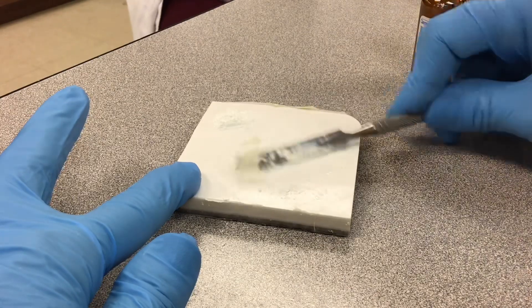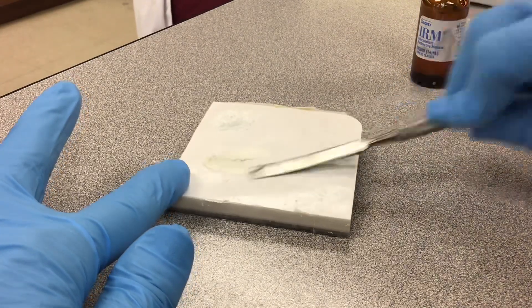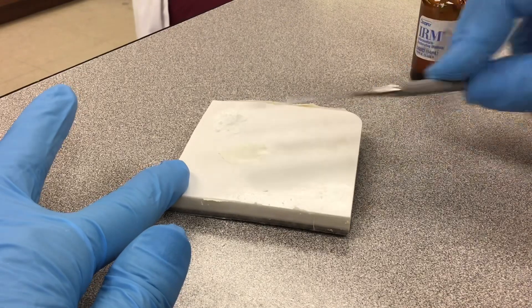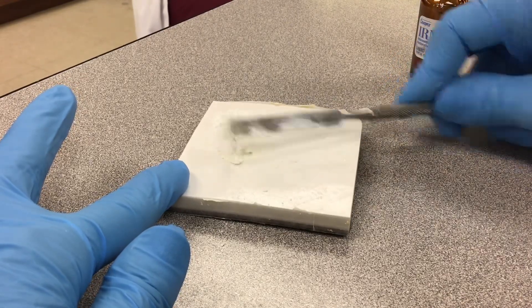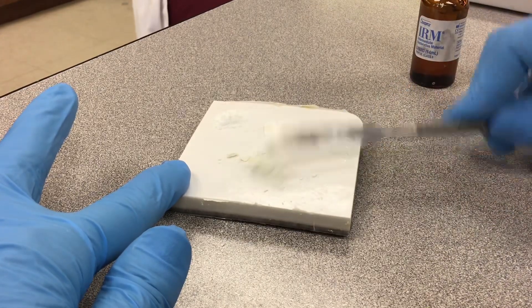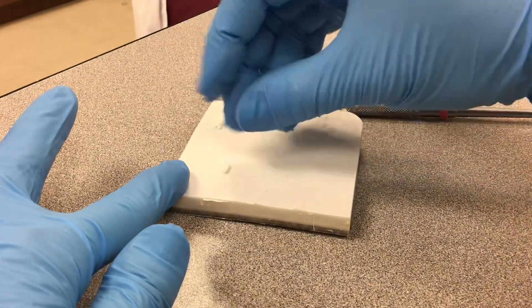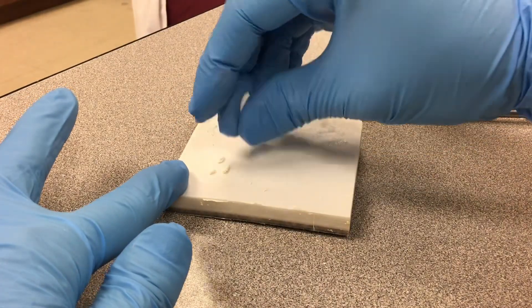See how it's sticking up? Now this looks pretty good. I'm actually going to roll it — see how it seems real flaky? I'm going to get it and roll it into my finger, rolling it into a ball.